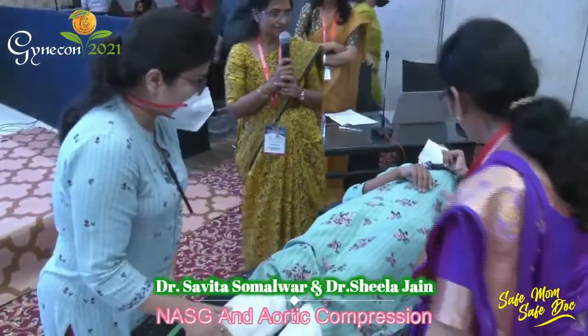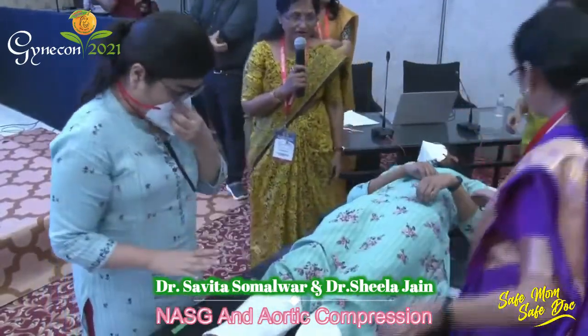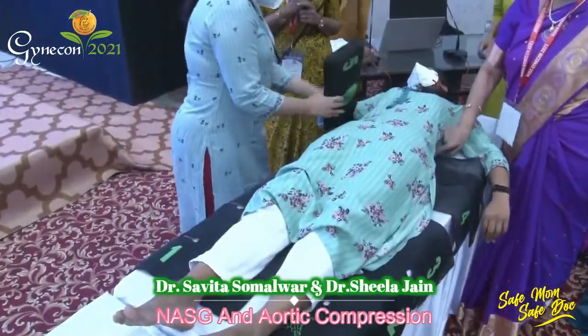Whenever you are placing the NASG, ensure that the upper border of the upper segment is at the lowermost costal rib.